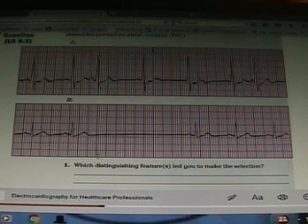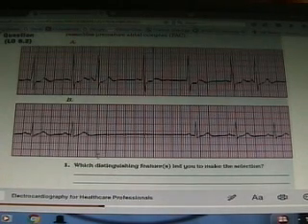Yep. And welcome to your final. This is exactly what your final is going to look like. Because you need to identify that. Just imagine if you told the doctor early, oh, it's a PAC. Then I have a whole bunch of things in my head that are now what? I'm now not thinking about the ventricles. I'm now not thinking about the bundle of His. I'm now not thinking of the Purkinje fibers. The only thing I'm thinking of, the second you say PAC to me, is what? Oh, he's got an atrial problem. SA node.